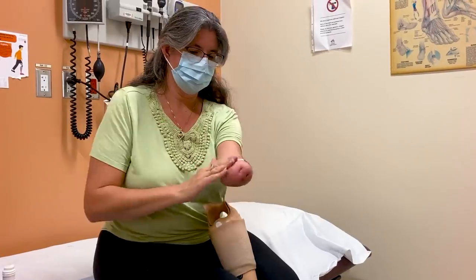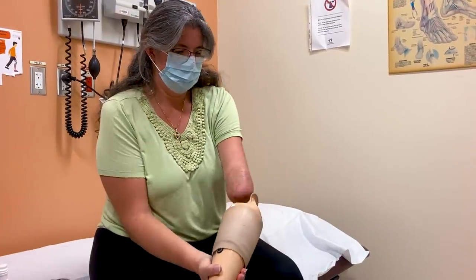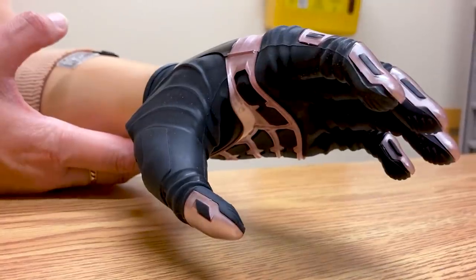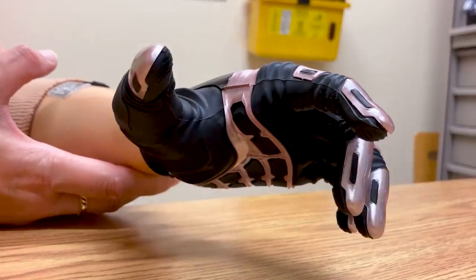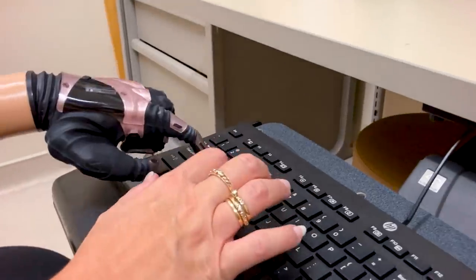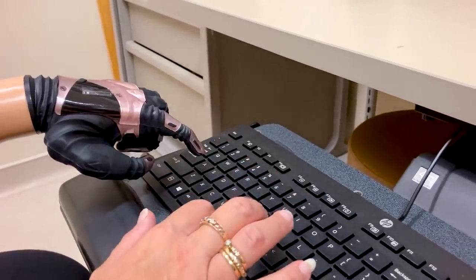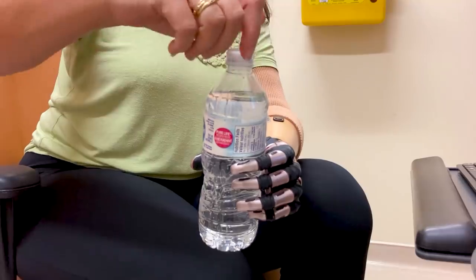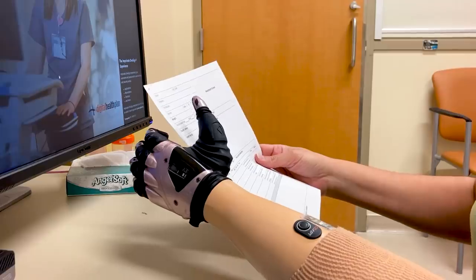The device needs to fit tightly, which is why Tracy puts on a cream so that she can slip into it more easily. Just imagine what it must be like for Tracy to do two-handed activities for the first time in decades. Things that most of us take for granted become possible as she practices using the prosthetic.